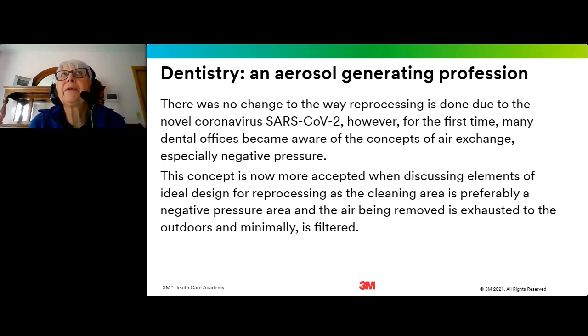The instructions from the standards team and from ANSI, from AAMI ST79, have in the past applied mostly to hospitals. Hospitals have to follow that in order to be accredited. More and more community settings are following the standards, and we're sort of dealing with the discomfort of the fact that we have probably never followed all of the standards, especially with design and especially with negative pressure.